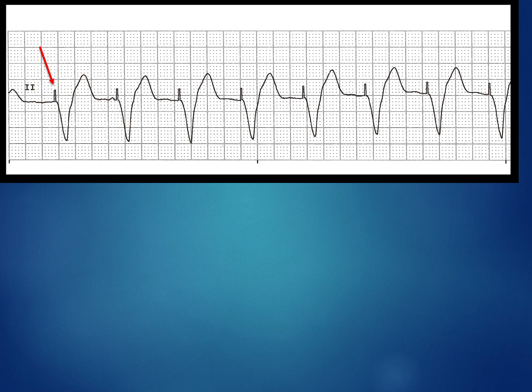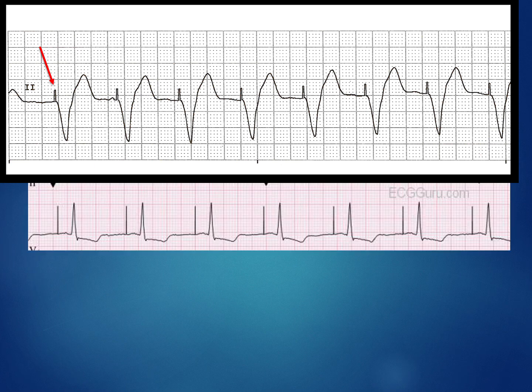Now let's look at another strip. What's going on with this patient? Pause the presentation again and consider your answer. So again, I see a very skinny vertical line that does not look like part of my normal EKG rhythm. Now what is following that pacer spike? I see a tiny P wave followed by a QRST. So there's only one spike, then a P, QRST. So this patient, because that P is associated with the atria, is atrially paced.